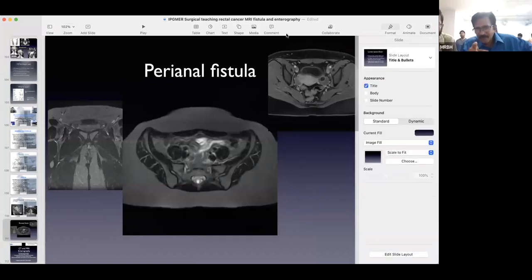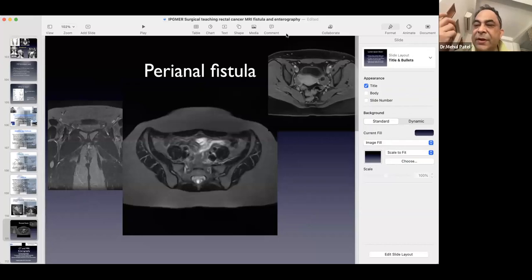If you have an opening higher up in the rectum, it is most likely not because of a primary anal gland infection. It might be Crohn's or some other pelvic abscess secondarily pointing out. So identifying that, can you make out on MRI that this is a blind track going up? Because in that case, treatment becomes easier. That is what we call a sinus. I should have shown you a picture.